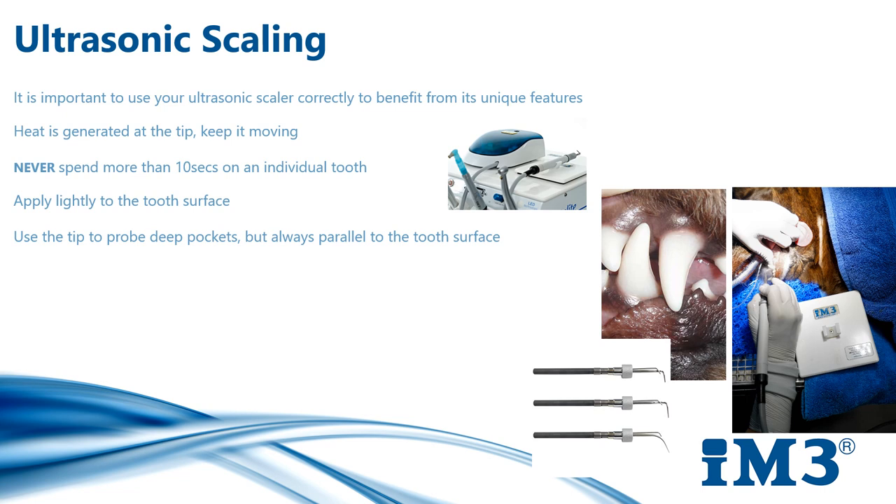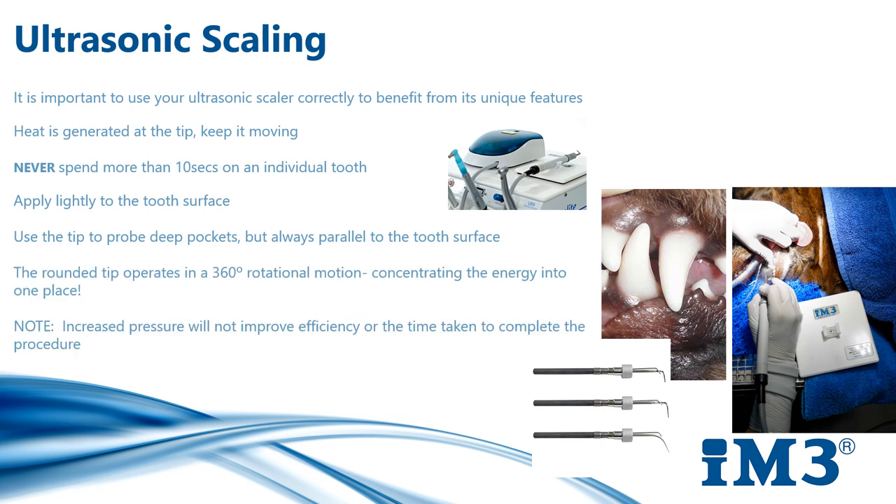Animal enamel is considerably thinner than human tooth enamel and therefore more prone to damage. Heat is generated from the tip, although the 4212 produces less heat than other machines and is therefore less likely to cause unintentional thermal damage to the pulp. Always keep the tip moving and never spend more than 10 seconds on each individual tooth. You can return to the teeth to finish off scaling. You only need to apply light pressure — just sweep backwards and forwards as though you are painting the teeth with a paintbrush.